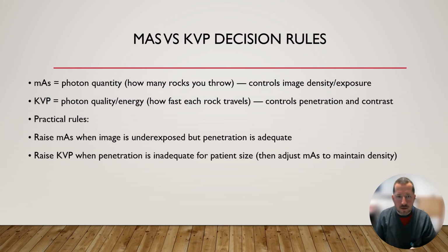How do we tell on these images? You can definitely speak with your clinical instructors, hoping that some of this makes a little more sense. Sometimes you have to look at the image. If there's not enough mAs reaching, it looks mottled, kind of blotchy. If it's too gray, that might mean there's too much kVp, and you might have to lower your kVp because too much scatter is reaching your image receptor. So you have to evaluate your images on a case-by-case basis, usually with some other factors.